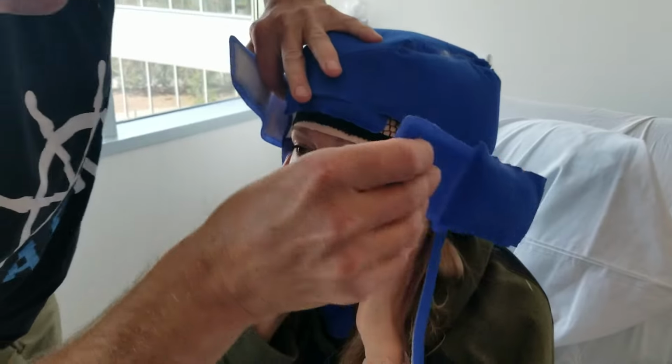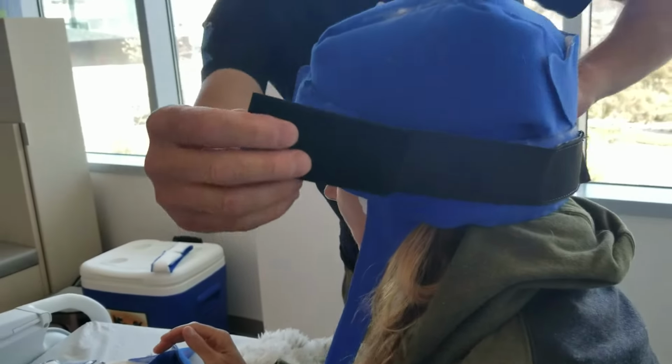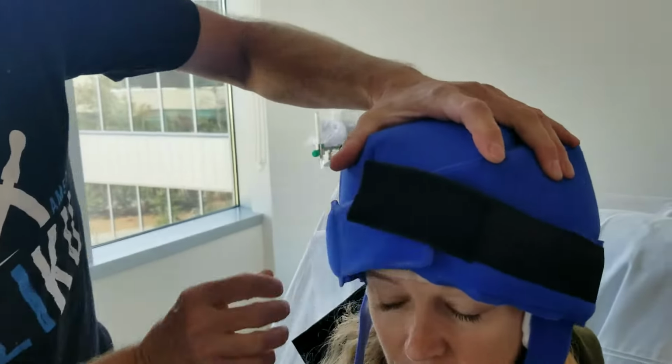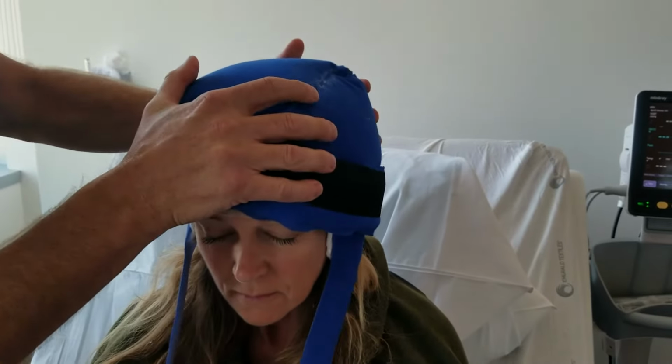And then what I do is you try to get it just to tighten that area up right there. Bring it in tight. And I'm doing this with a little force, as you can see. So you can see I've got that area covered. And then that's where this third strap comes in. What you want to do is, if you put it along the back, just follow the line of what you just put on there. So you get it nice and tight. You want to create a nice tight seal around that area, or else you'll lose the hair in that area. So now the cap is on.